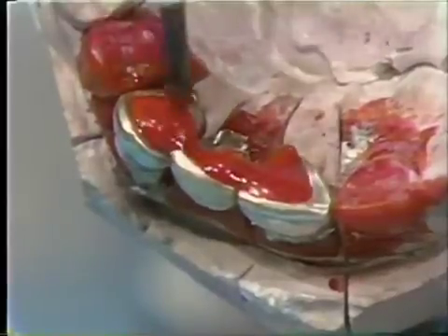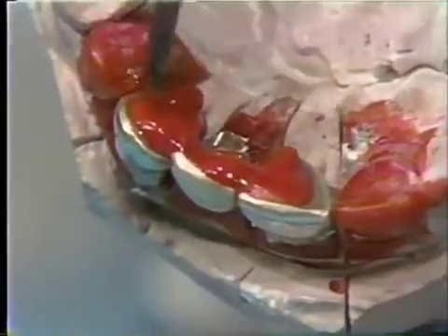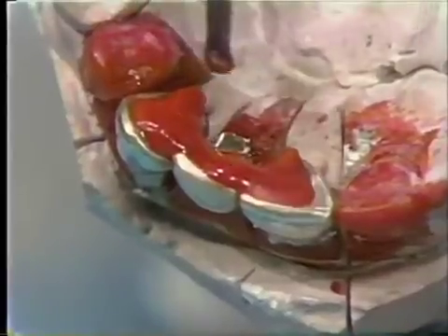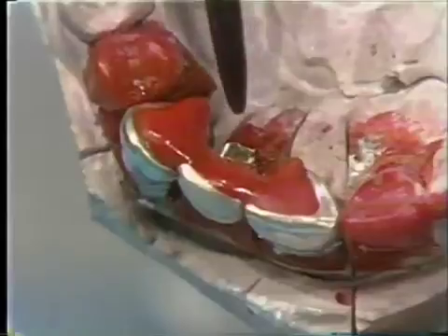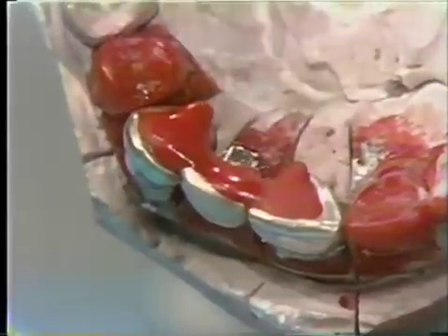The Duralay is carefully flowed across the pontic and onto the cuspid casting, and then around the cuspid knock-off lug. It's important to keep the Duralay away from the pins of the pin facing. Should the Duralay get in this area, it could lock the facing in place and make it difficult to remove.